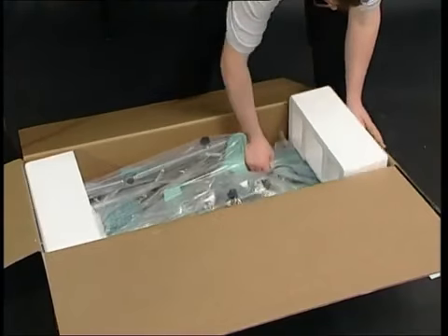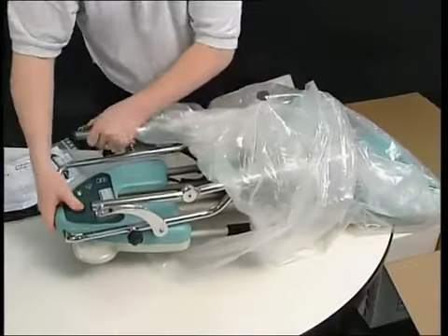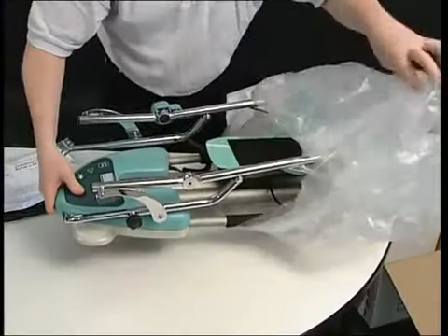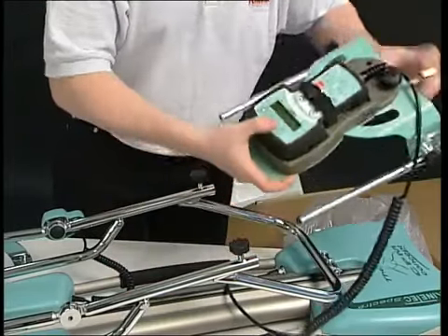Take the machine out of its box and place it on a table. Remove the plastic bag. Put the foot plate in position and remove the remote control.